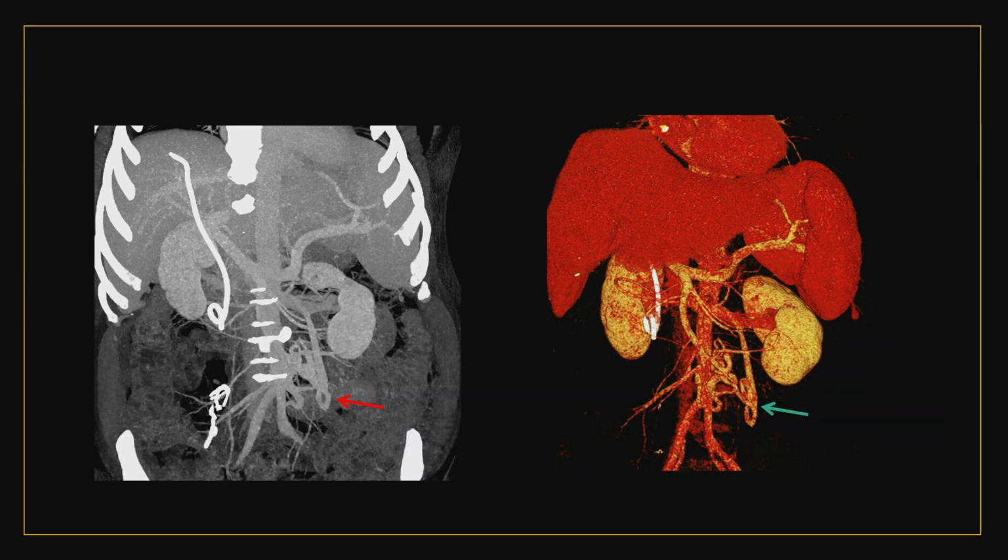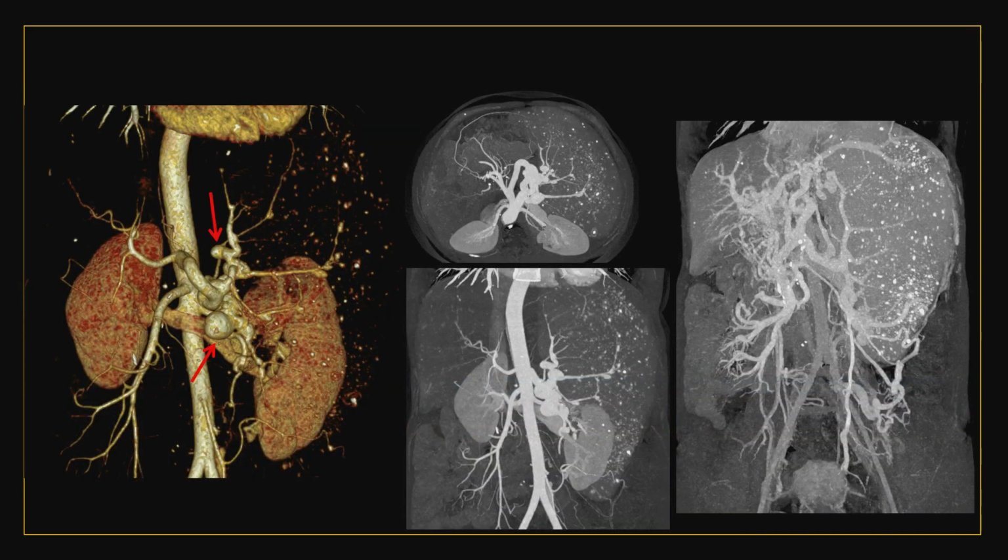This is another case. In the last case I showed you, there was a shunt draining into the superior surface of the left renal vein. Here we see a shunt which is going from the mesentery. So this is the superior mesenteric vein, lower part. There are mesenteric collaterals draining into the inferior surface of the left renal vein. So this is a mesenterico-renal shunt or mesorenal shunt. Usually it may or may not go through the gonadal vein. So here this is an example of a mesorenal shunt.